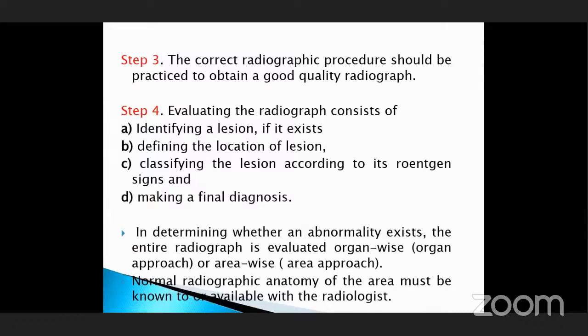Another is that the normal radiographic anatomy of the area must be known to the radiologist. You must know what is normal. Only then can you say if there is some abnormality, and you can detect it.